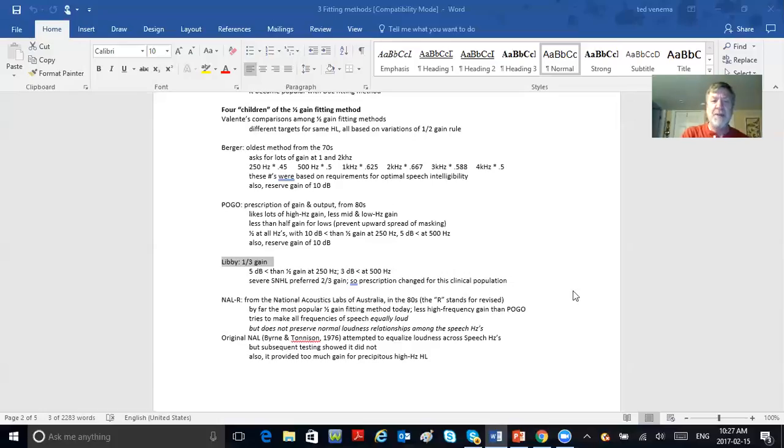Libby said outer hair cell pathology, they like third gain, 1/3. Neural, more severe hearing loss, 80 dB sensory neural loss, they tend to want power. They want 2/3 gain. I find that kind of interesting. I just find that kind of cool. He's the first one that ever really kind of addressed that.